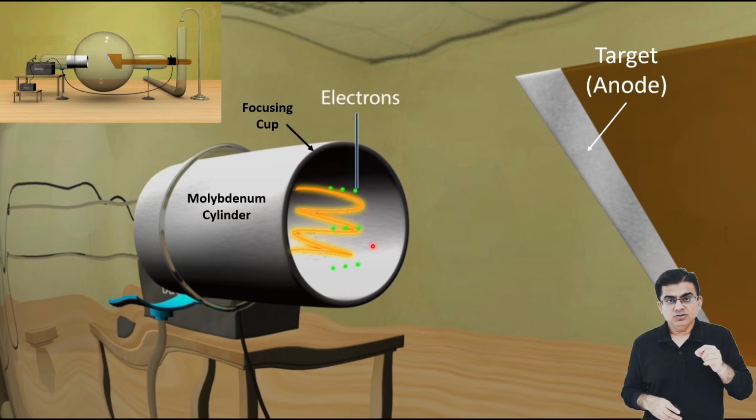Now it is time to put these stationary electrons into motion. How do we do it? To do this, we instantly apply a massive electrical voltage across the entire tube. You remember that large electrical circuit connecting the cathode and anode here? This provides a very high voltage needed across the empty tube to create a massive potential difference.